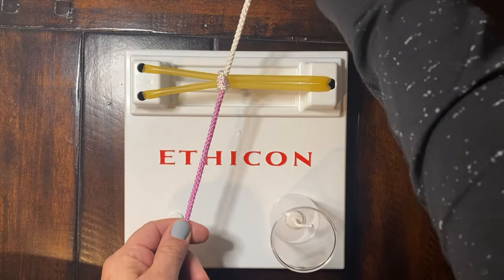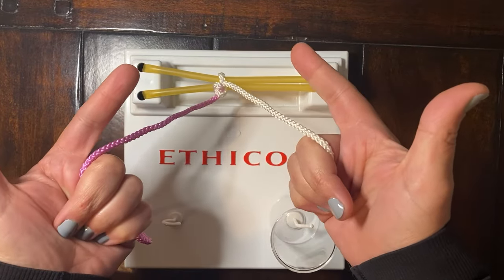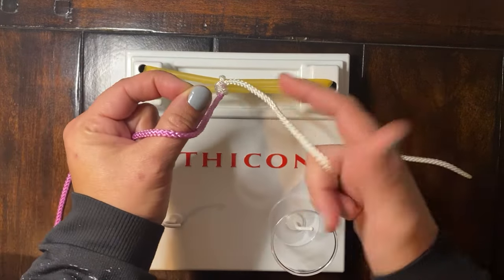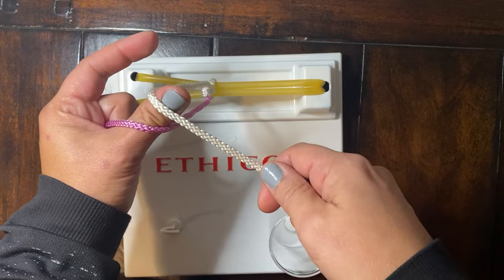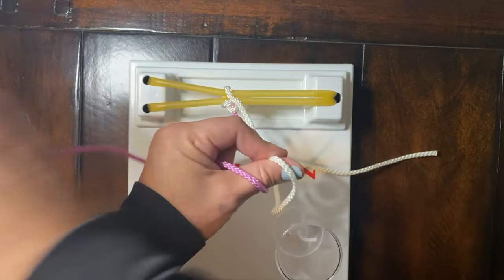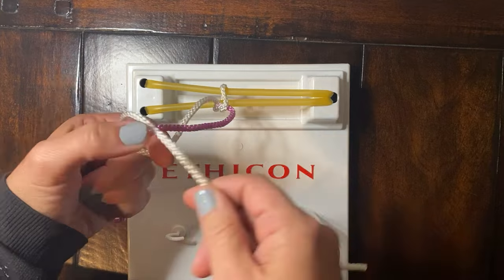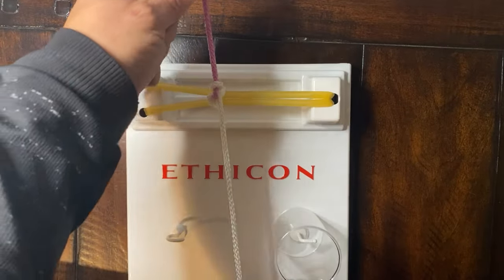Our second series of steps are the same — we start with our pistol grip. The left hand comes down around the ring, but we need to alternate. Last time we came towards ourselves, so this time we're going to go away. That naturally wraps the suture around the thumb. We'll open the ring, cross in the opposite direction — again, white is now towards you, purple is away. Open the ring to cross, close it, rotate through, open the ring to pinch the free end. Last time we rotated back; this time pull towards you.